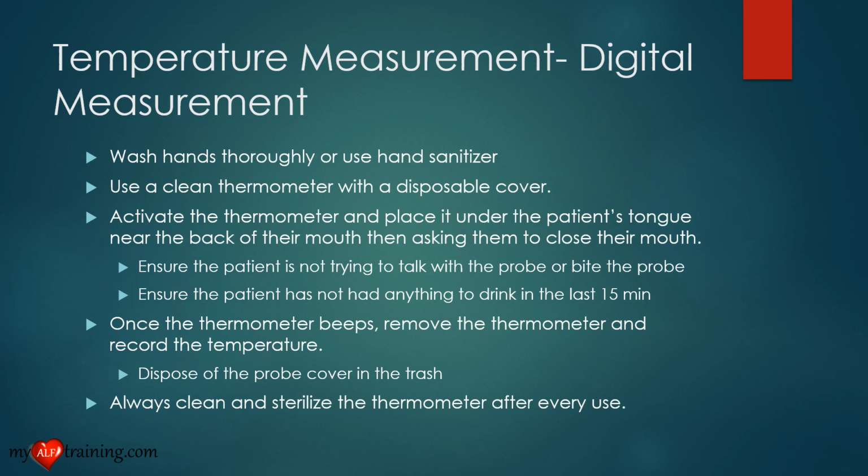We also need to make sure the patient has not had anything to eat or drink in the last 15 minutes. Either of these will cause the accuracy to be called into question. Once the thermometer beeps, we're going to remove the thermometer and record the temperature. Dispose of the probe cover in the trash. And once completed, always clean and sterilize the thermometer after every use.